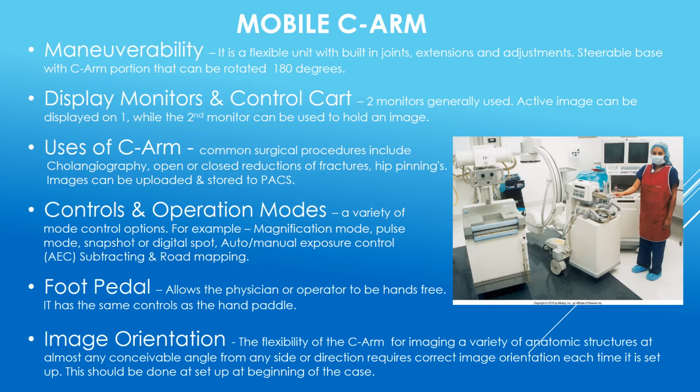Image orientation. The flexibility of the C-arm for imaging a variety of anatomic structures at almost any conceivable angle from any side or direction requires correct image orientation each time that it is set up. This should be done at the beginning of the case.